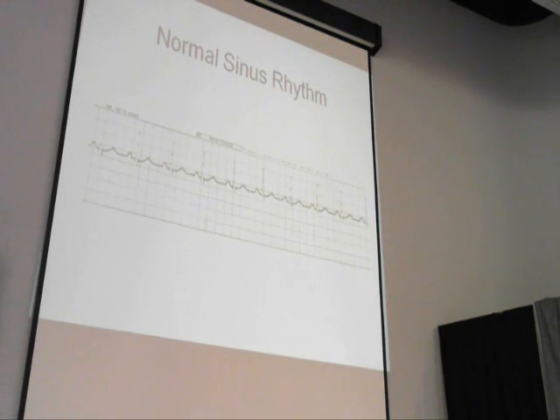And again, those time frames. What is the PR interval? And the QRS duration, what is it? The PR interval is basically all the electrical activity above the ventricles. It's the time frame, 0.12 to 0.20 seconds. That's how long it should take for the SA node to fire and send it on and it gets to the ventricles. It's basically the time for all the electricity above the ventricles.